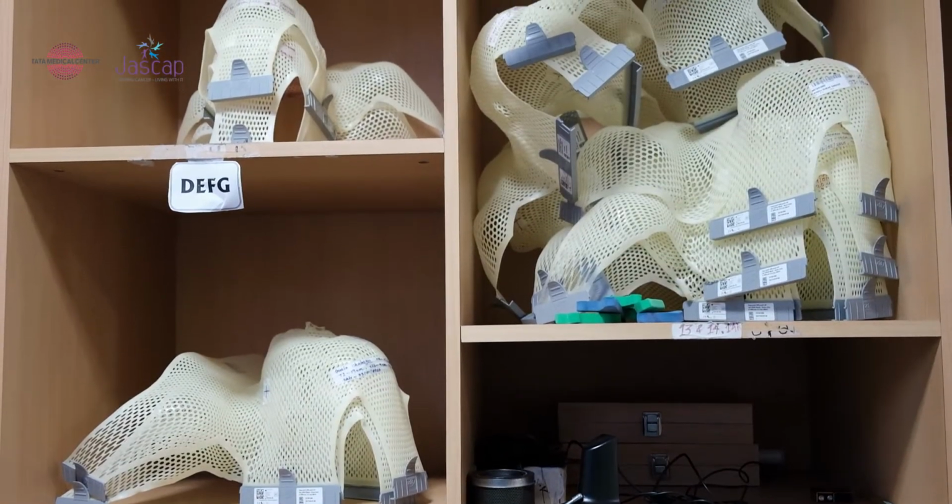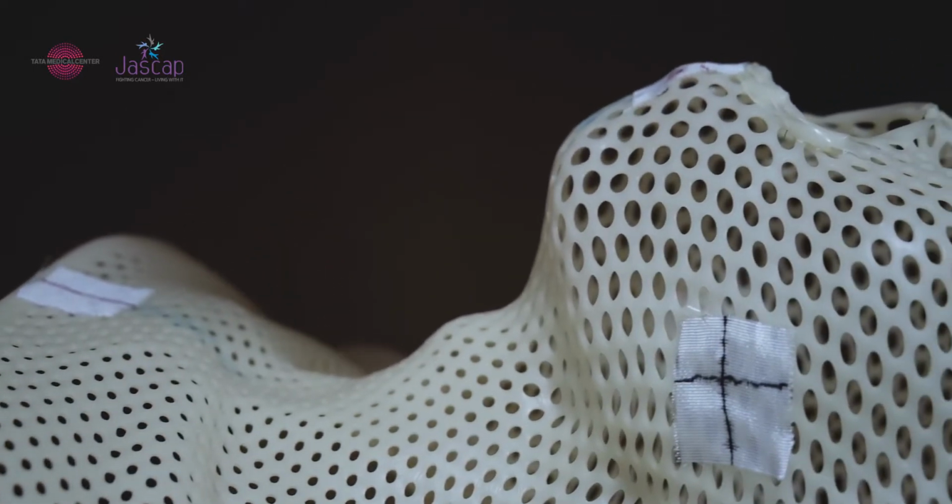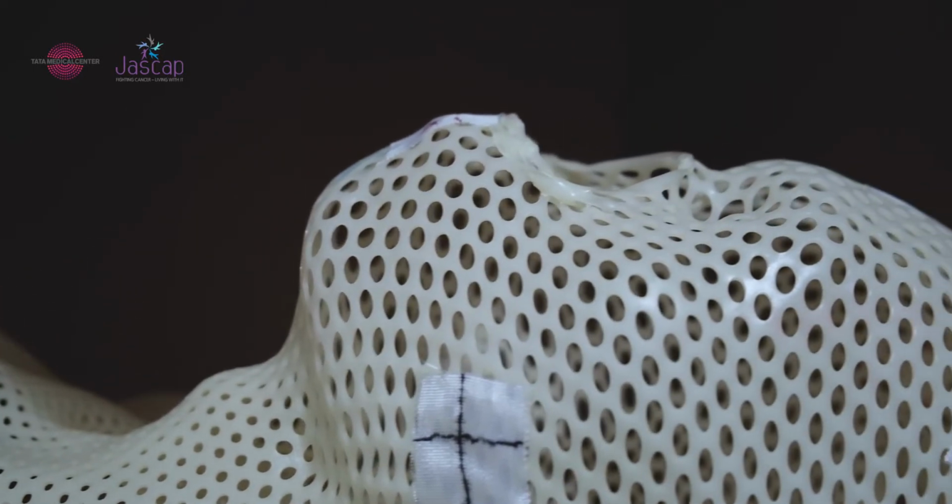We often make some devices called immobilization devices so that there is no movement on the actual treatment machine when you receive radiotherapy, so that radiation is actually delivered where it is supposed to be delivered. On the planning day, depending on where you would receive radiotherapy, our radiographer team would be positioning you in particular positions. Often somebody will tell you, well, ma'am, hold your breath and count 3, but people will be training you. So there is no need to be fearful of the appointment.